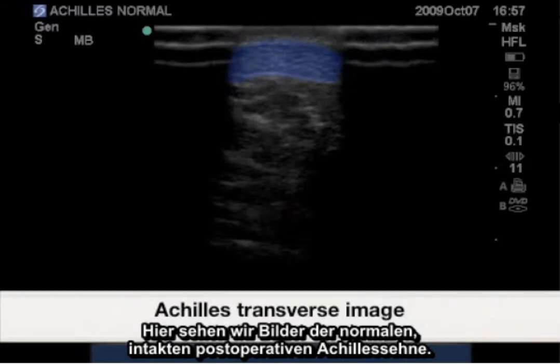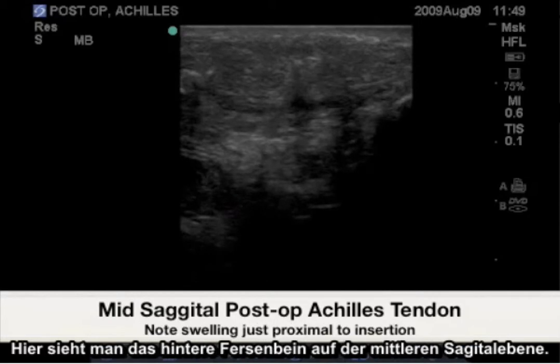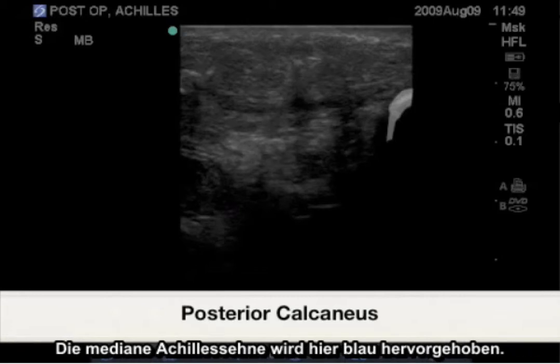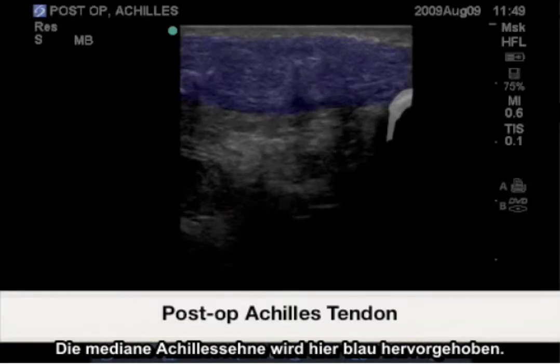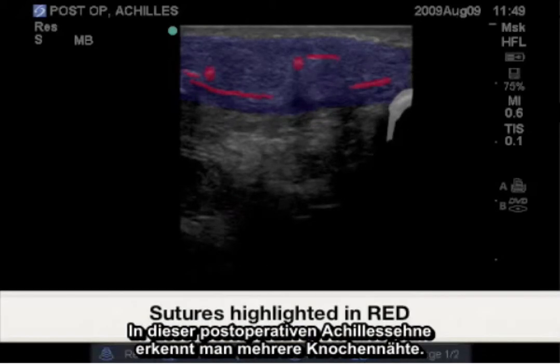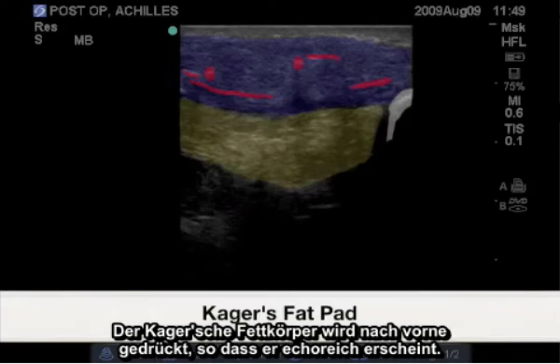Here we will see images of the normal intact post-operative Achilles tendon. Highlighted here is the posterior calcaneus in the mid-sagittal plane. Highlighted in blue is the mid-sagittal Achilles tendon. Highlighted in red are the multiple sutures present throughout this post-operative Achilles tendon. The Kager's fat pad is compressed anteriorly, making it appear hyperechoic.